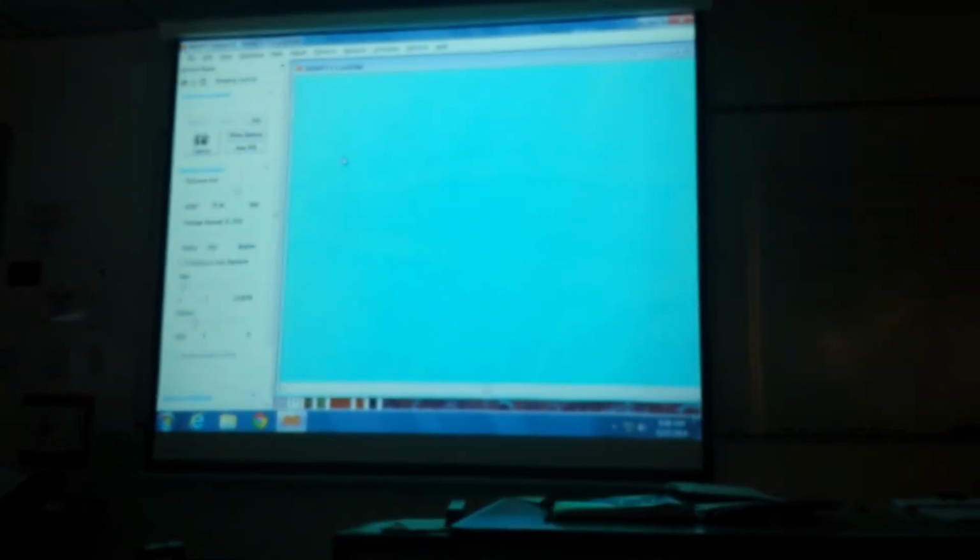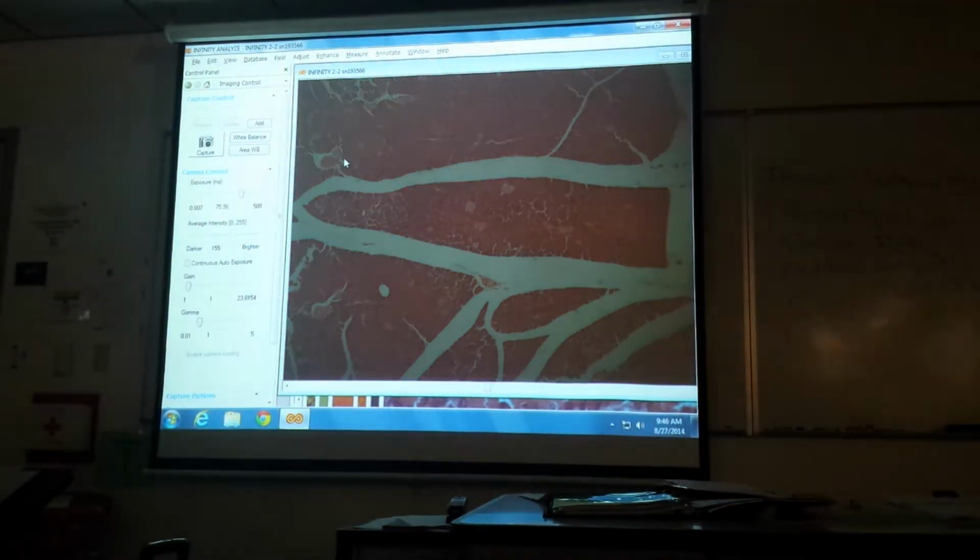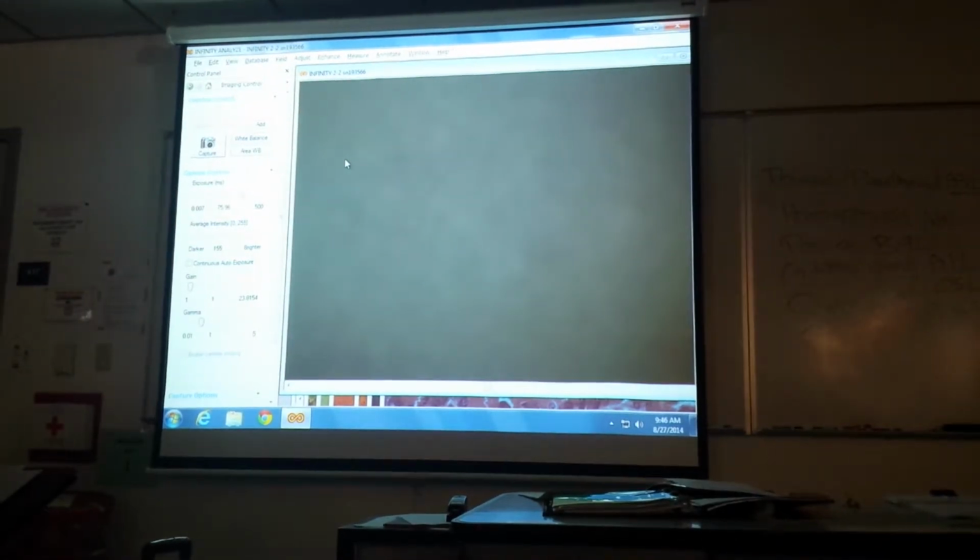Adrenal gland. This is our stress organ.